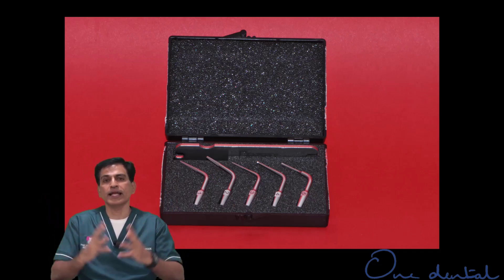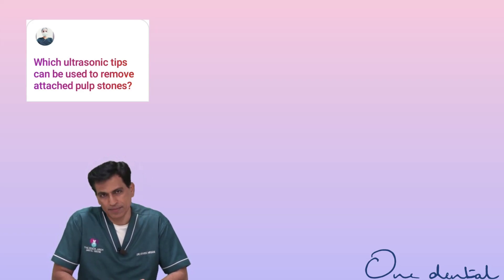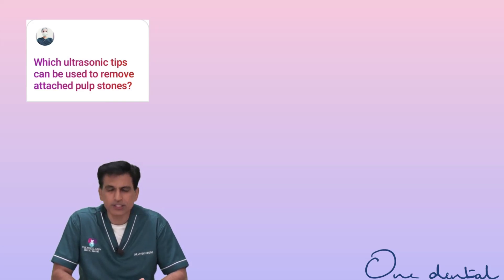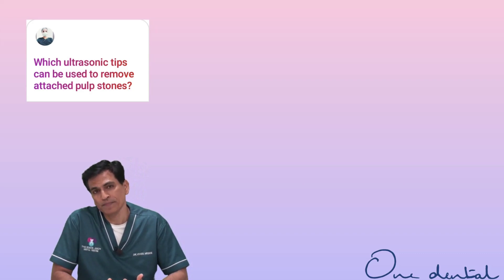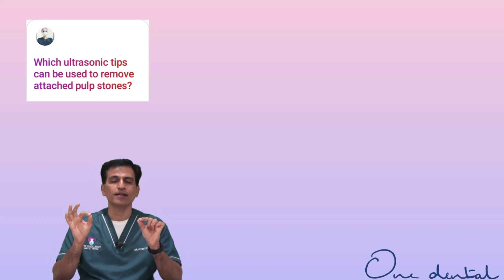For broader, stout tips you can use steel or diamond. For thinner tips, you may use steel or diamond, but additionally you have zirconium, titanium, and a newer material called niobium. All these materials are good, but the last three cannot be used at the entry level because they are very expensive, very thin, and fragile — they will break.